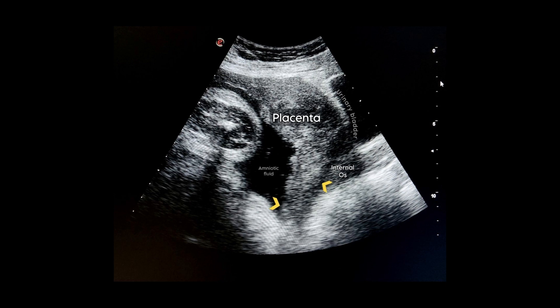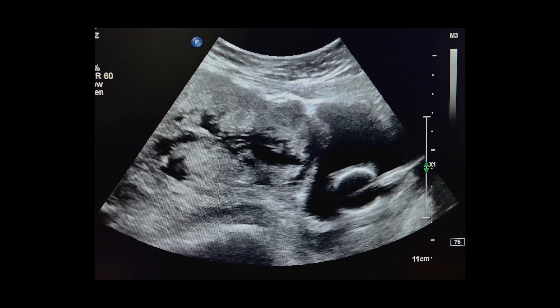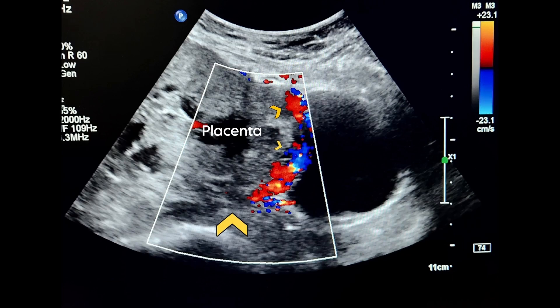This is another patient where the placenta is completely covering the internal os, so grade 4 placenta previa. In this patient, the internal os is covered by the placenta, which is also extending across the myometrium and reaching up to the urinary bladder. On Doppler there was a lot of vascularity in the bladder wall, so this is also a case of placenta accreta along with placenta previa.